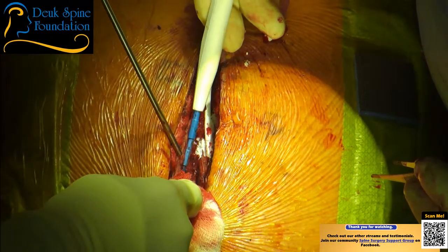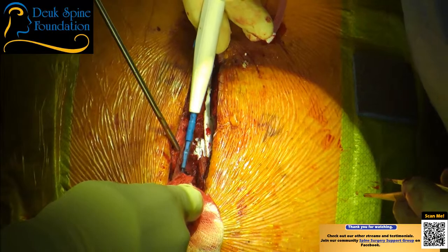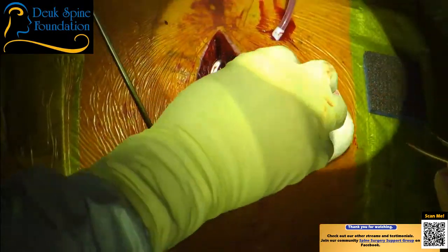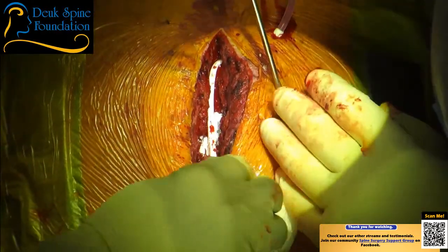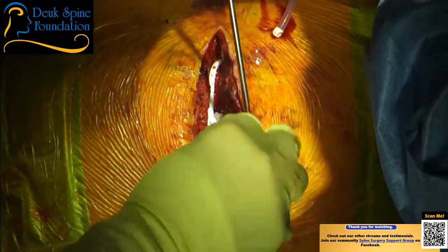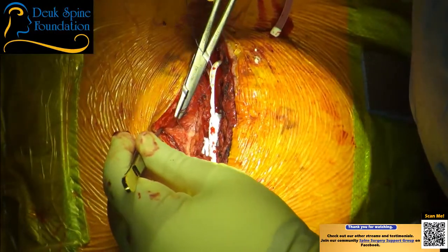Little bit of oozing's okay when you close a wound like this. You've got a drain. You're going to have the edges of the wound pressuring on each other. Should be good. Let's get the drain hooked up and let's close. Stitch. All right, so just like with a lumbar, you only close the fascia. You don't close the muscle.